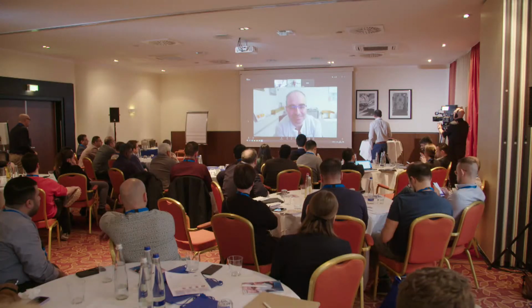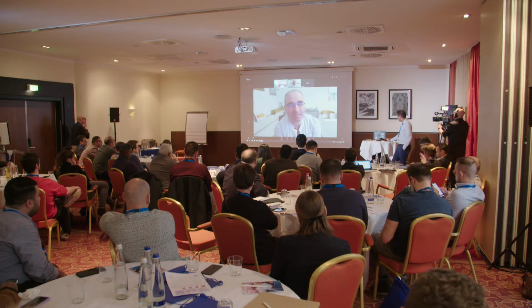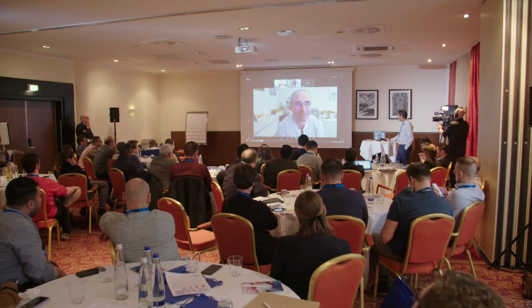Iliacs? Do you have any? Have you used it for the external iliac or the common iliac? We have some very, very limited experience, but my personal opinion is that the devices we currently have for atherectomy are not really appropriate for the big iliac vessels.